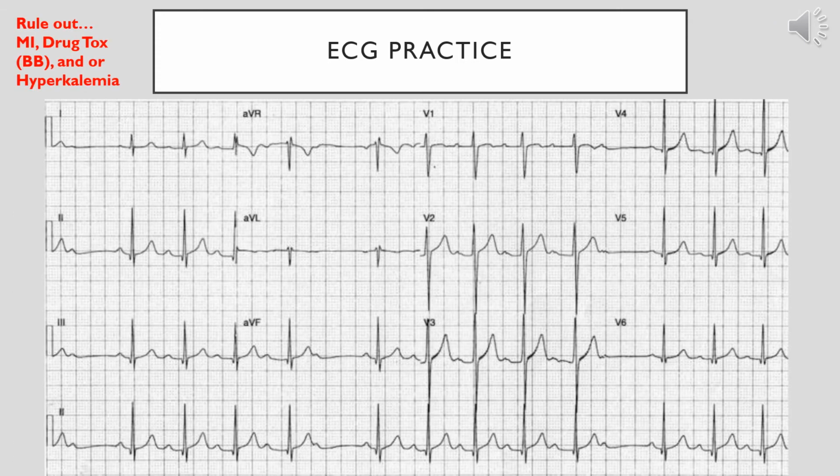First look at this EKG, you notice right off the bat, from the beginning of the strip, there's a dropped QRS. Looking at this EKG, we're dealing with some sort of block, because as you're looking, there are 3 P waves that are not followed by a QRS. So that can definitely be a sign that there's some sort of heart block going on here.